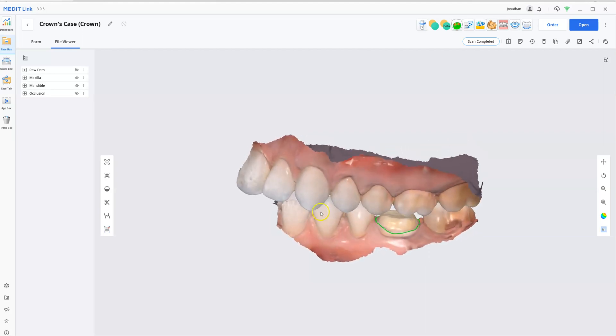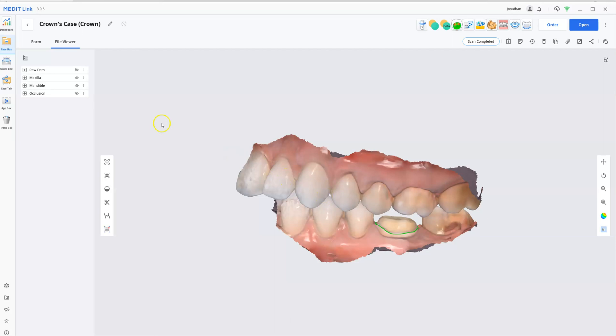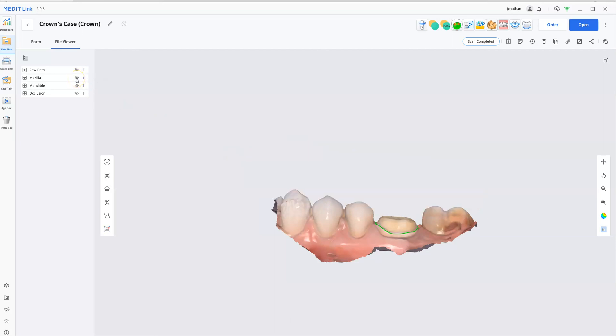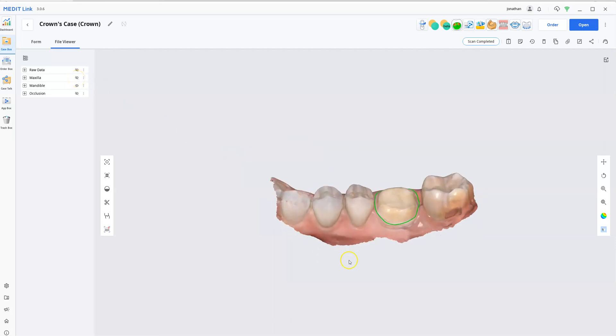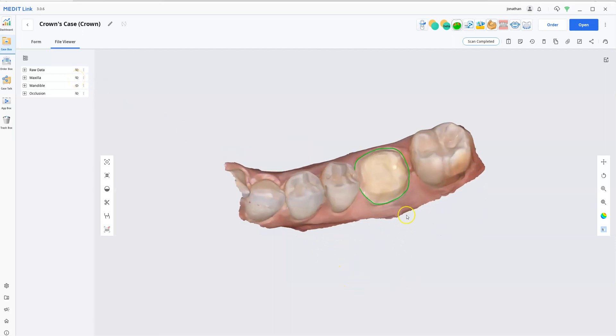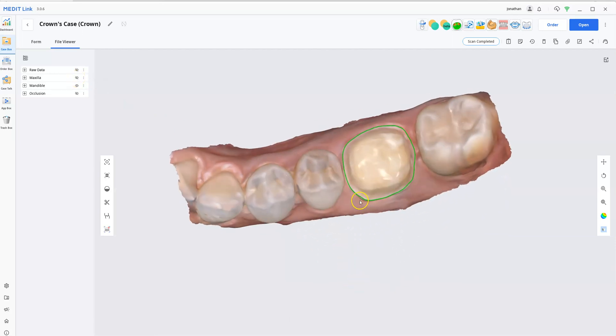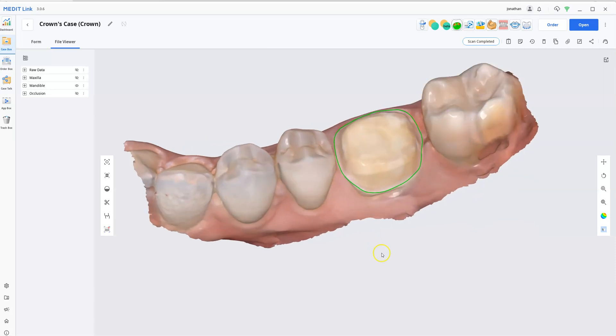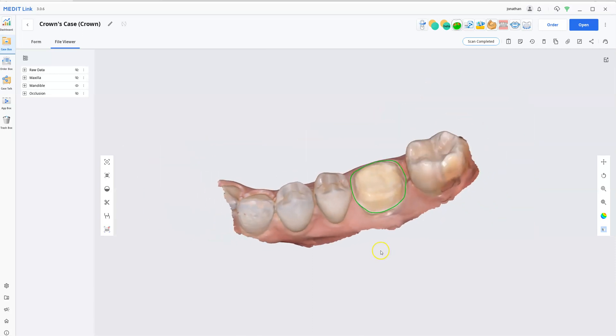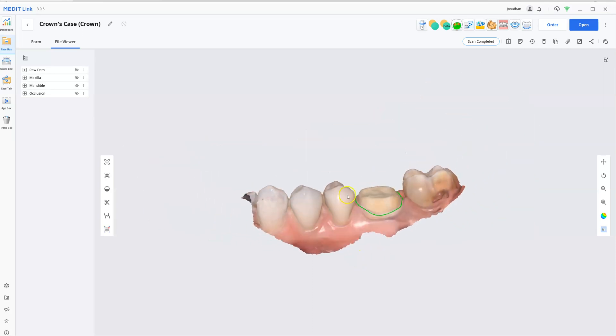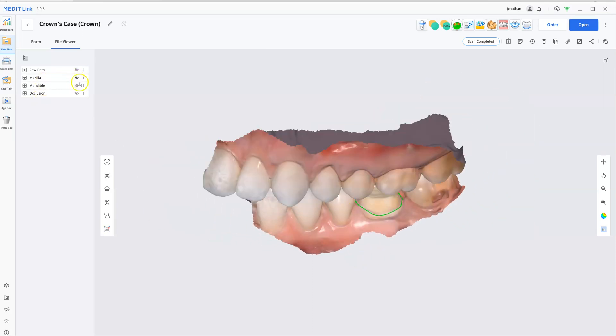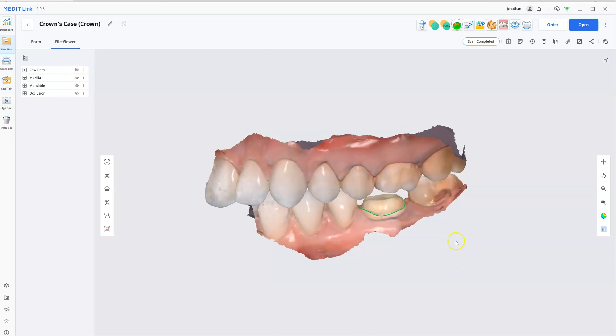So this scan was taken in MeditLink and you can see that we have the upper jaw, the lower jaw, and the bite that were all taken. And we did draw the margin inside of MeditLink in this case and the models have been completely rendered and they're ready for their design process.